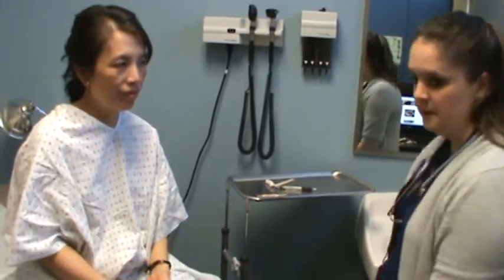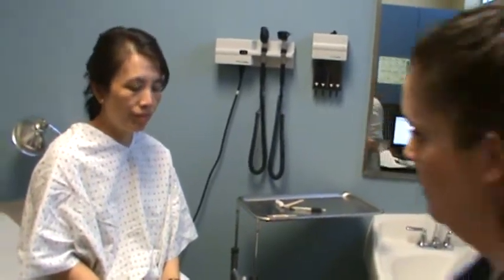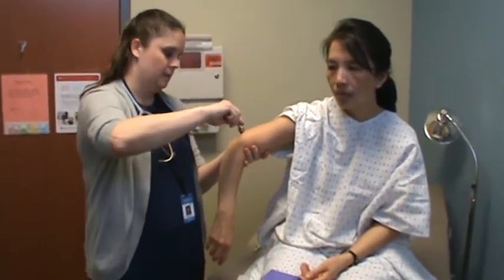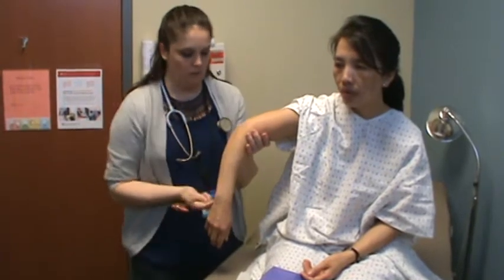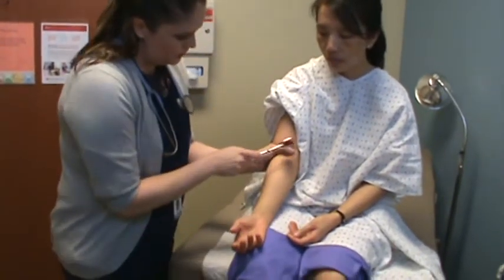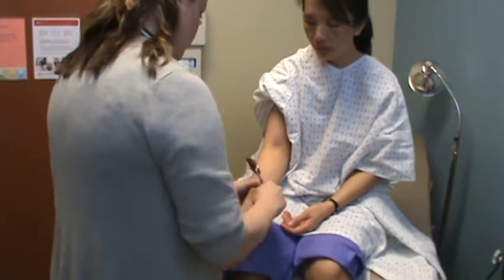Let's check your reflexes next. Get my hammer here. First we're going to do her tricep. Deep tendon reflex. Okay, that looks good. And I'm going to have you just lay back here. I'm going to feel her bicep. Okay, good. And we're going to do the radial.